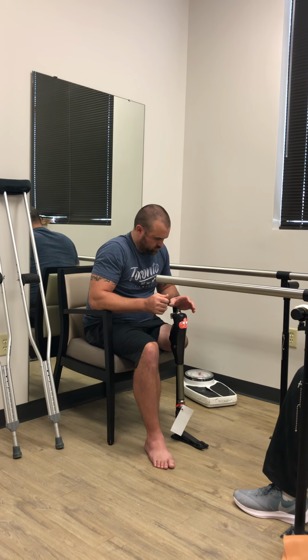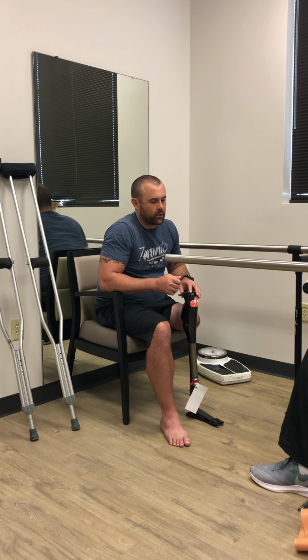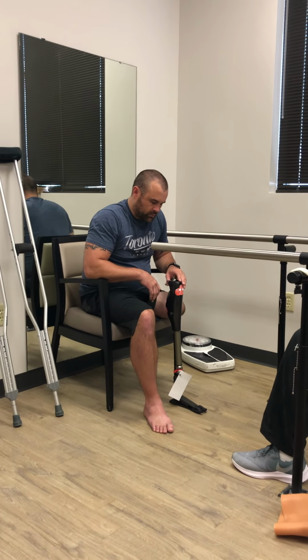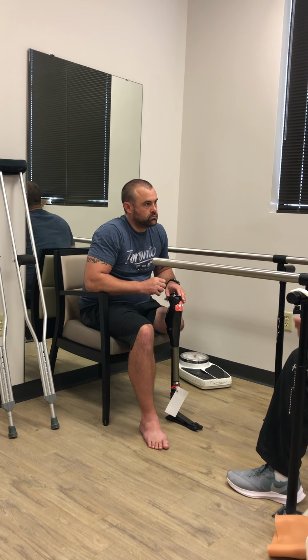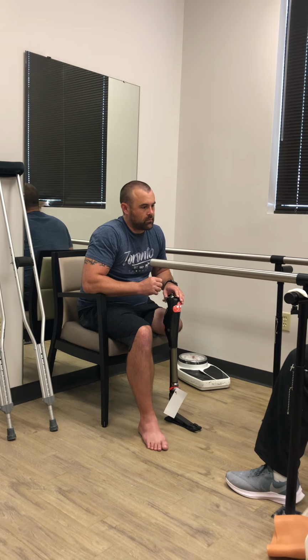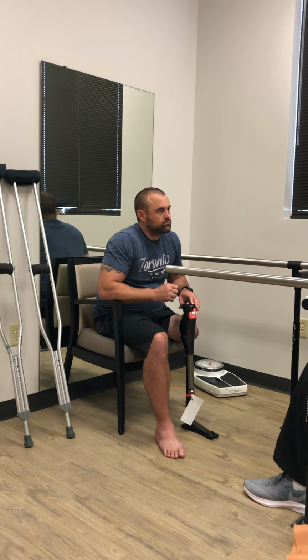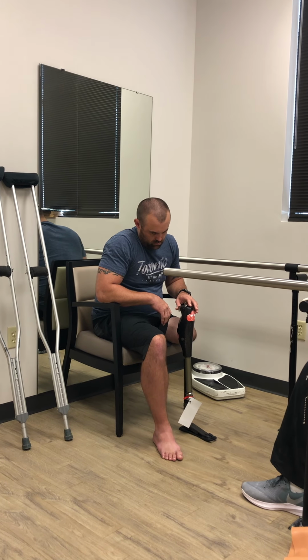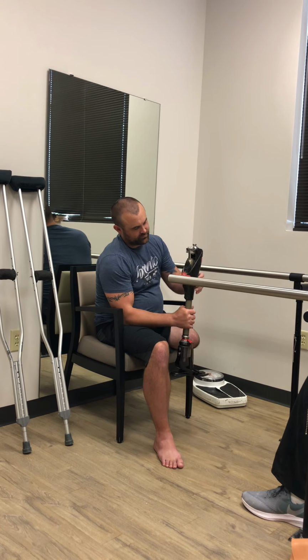Okay, so we'll see exactly where we are. I'm going to get a measurement real quick, hopefully at your knee center, and that way I'll have a good idea. Then we'll be able to get a little bit closer. Like I said, with your limb length we'll have the extra room, it's just a matter of what your preference really is. If it's a half inch higher or whatever, it's going to be fine.